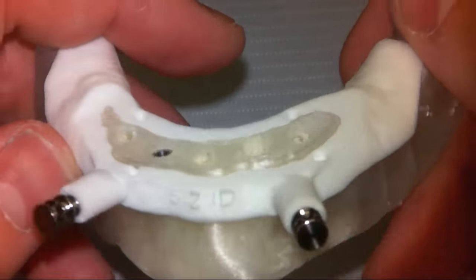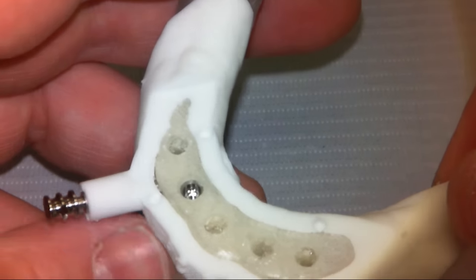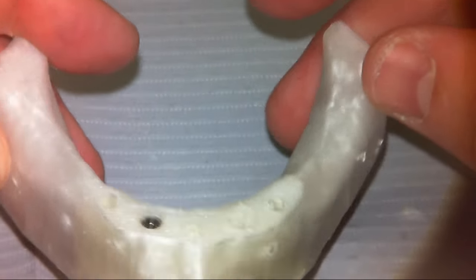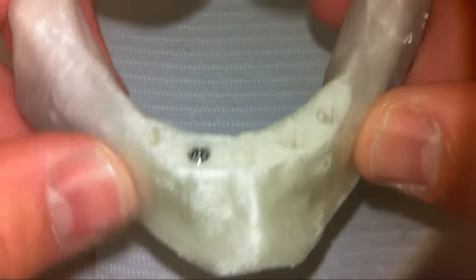I'm not going to place all these implants, but you can see that's exactly where I planned it — about a millimeter and a half subcrestal. The guide is nice and stable; at any point we could take it off, and once the case is done we'll have five implants in the mandible exactly where they need to be. I hope you found that helpful. Thank you.